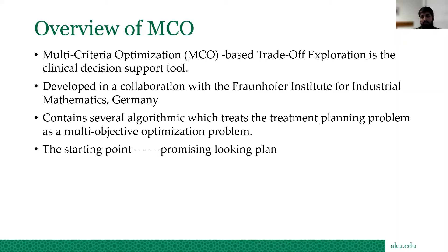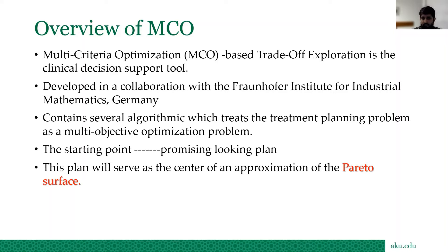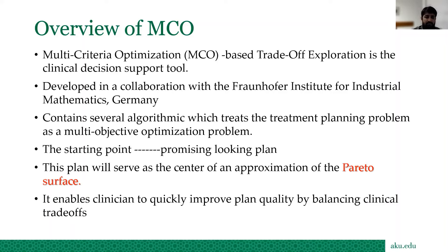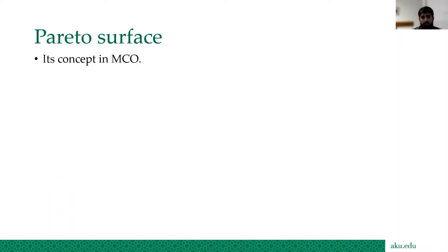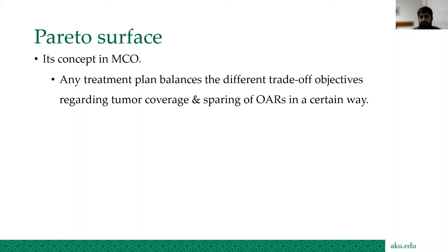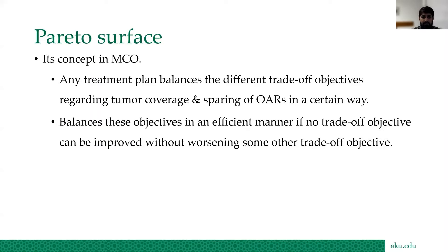You are comfortable with that plan for showing to the doctor, so this plan serves as the center of approximation of the Pareto surface. It enables clinicians to quickly improve plan quality by balancing clinical trade-offs. The Pareto surface concept means that in MCO any treatment plan balances different trade-off objectives regarding tumor coverage and sparing of OARs in an efficient manner, where no objective can be improved without worsening another.